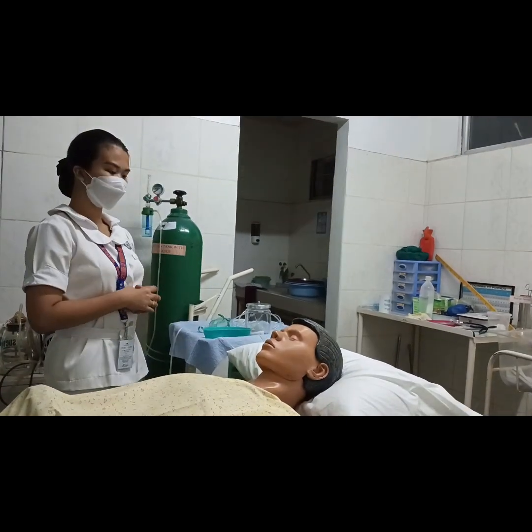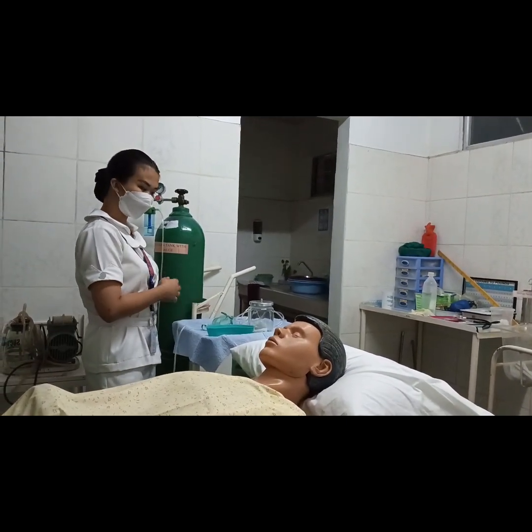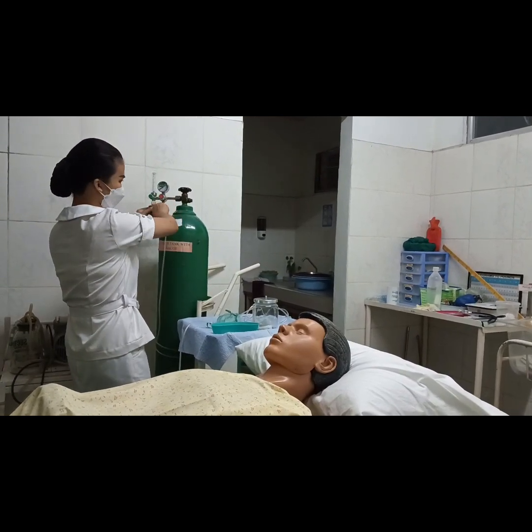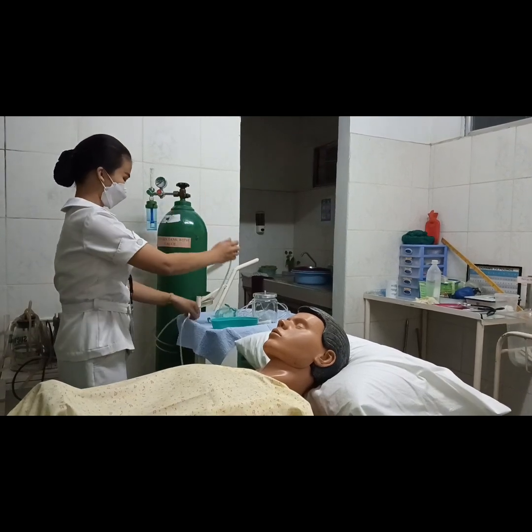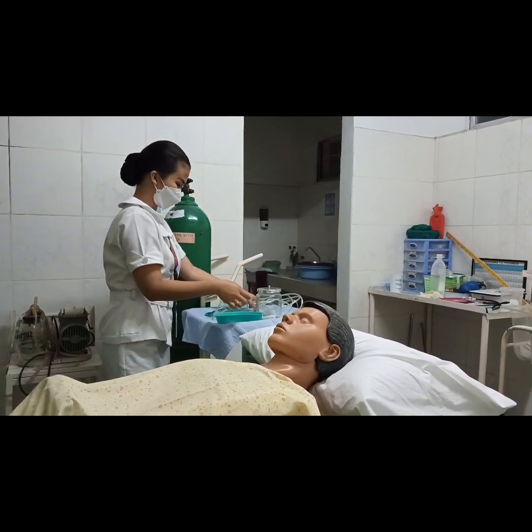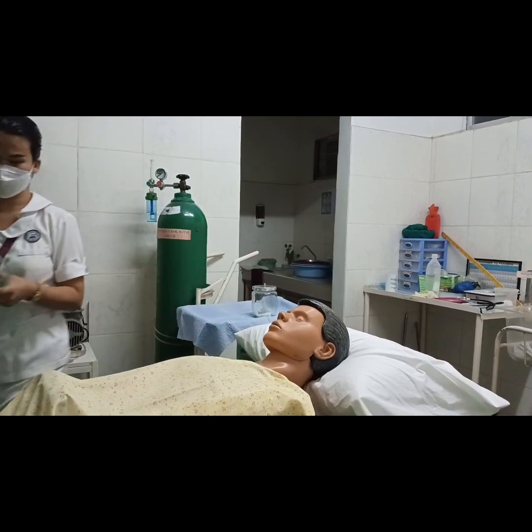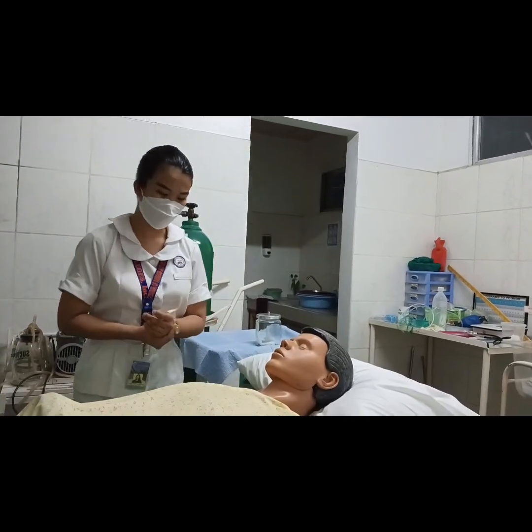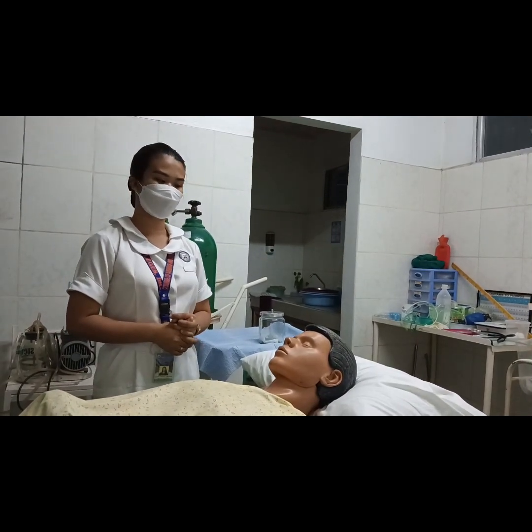Next, I will discard all the equipment used appropriately, then wash my hands to reduce the transfer of microorganisms.